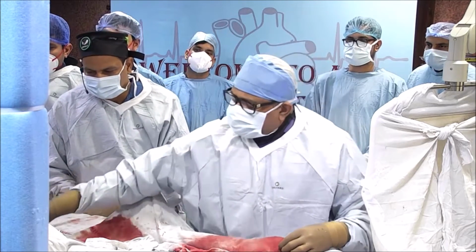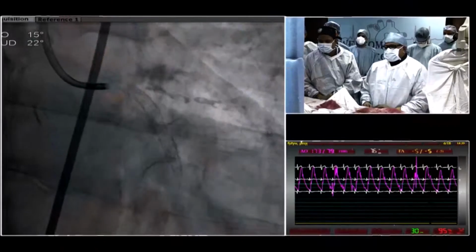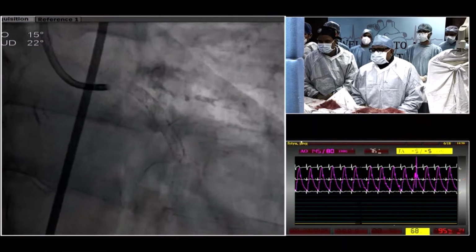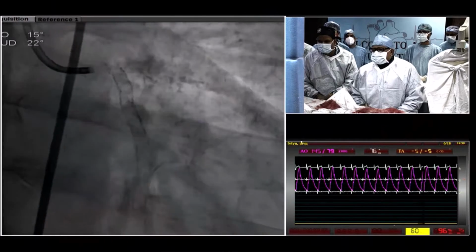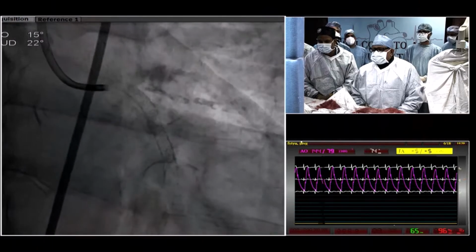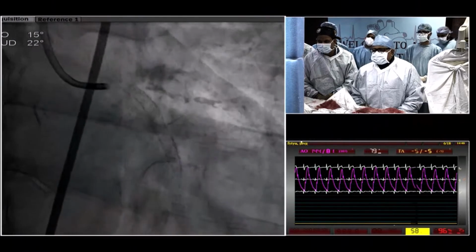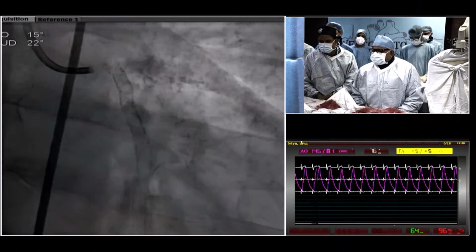So, Rajesh, what we have understood till now is that he has already undergone a PCI stent of RCA and PCI stent of LCX in 2016 and got restenosis, and now you have treated the in-stent restenosis using a cutting balloon and then put a magic touch. Looks to be a big vessel, looks to be a great result. And highly calcified LAD is now the target vessel that you're going to do. So, what is your strategy for the LAD? Absolutely right.